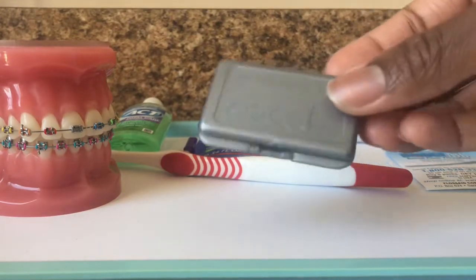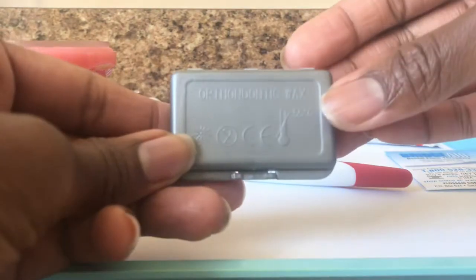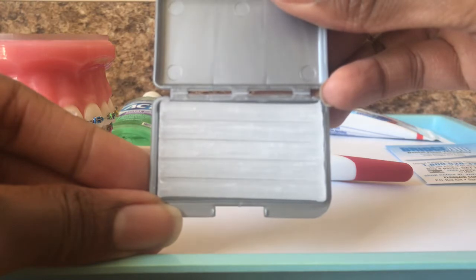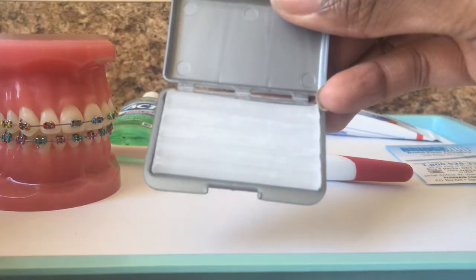Next, we have your wax. Your wax is used typically when the braces become irritable on the lip, and if you have a wire poking in your cheek. Also, for example, if you get a busted lip and it's rubbing across that metal bracket, that can be really irritable as well, and you definitely would want to use your wax.